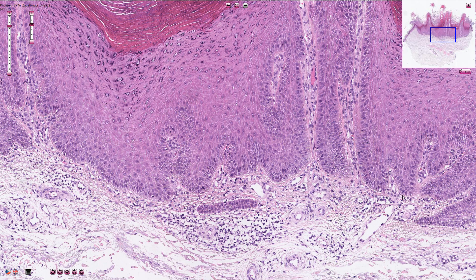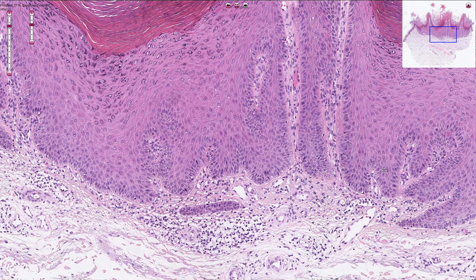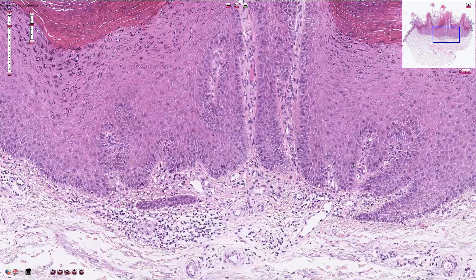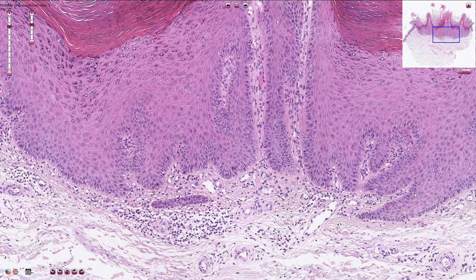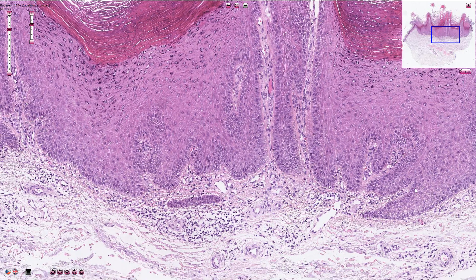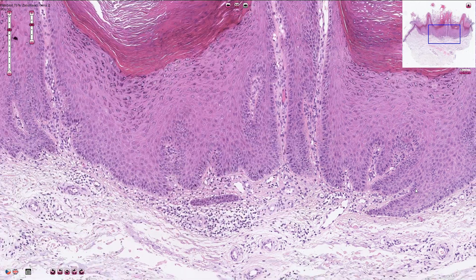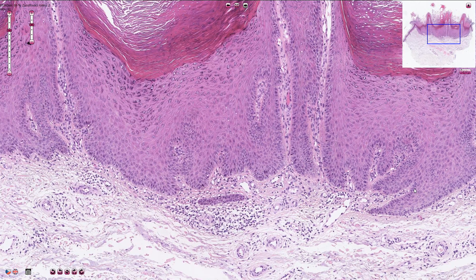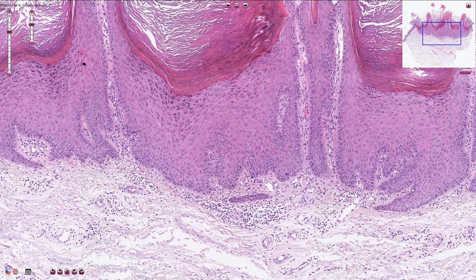In the case of an irritated lesion, we can sometimes also find reactive atypia of the keratinocytes, and squamous cell carcinoma is an important differential diagnosis.